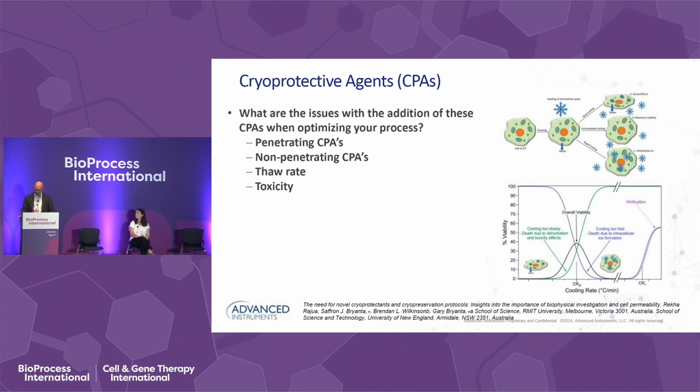Non-penetrating CPAs act by increasing the osmolality of the extracellular environment, which causes cell dehydration, thus requiring a slow cooling process. This then results in a higher concentration inside the cell, which inhibits intracellular ice formation. Non-penetrating CPAs can also be used in the thawing media to prevent osmotic shock and lysis, and to prevent the return of water to the cells, stopping traumatic expansion.